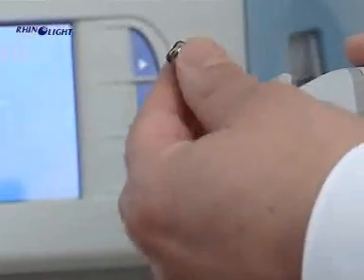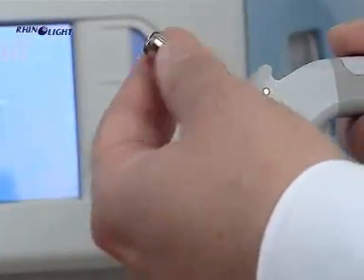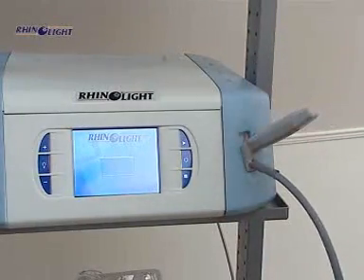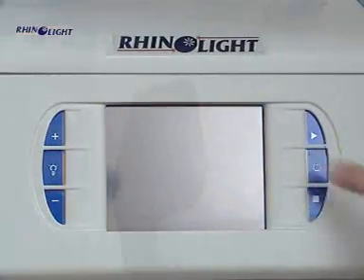The nasal attachment is removed and disposed of as soiled. The treating head is placed back in the holder. The light source and finally the equipment is switched off.